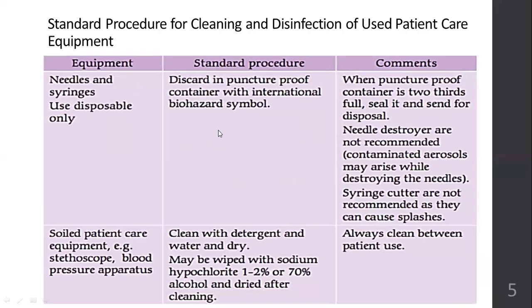Needles and syringes are never reused. It's always a standard procedure to discard them in a puncture proof container, and the container should have the biohazard symbol.